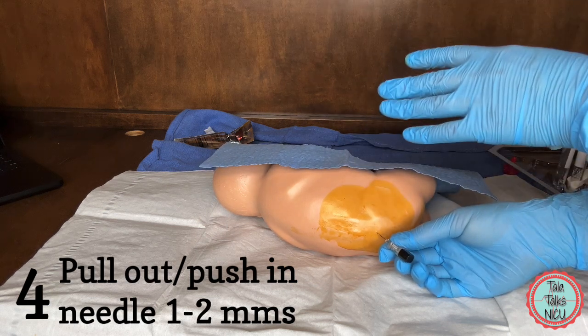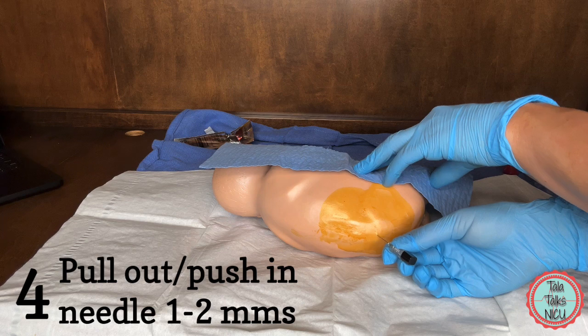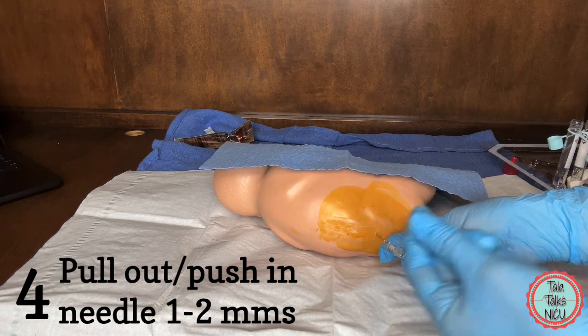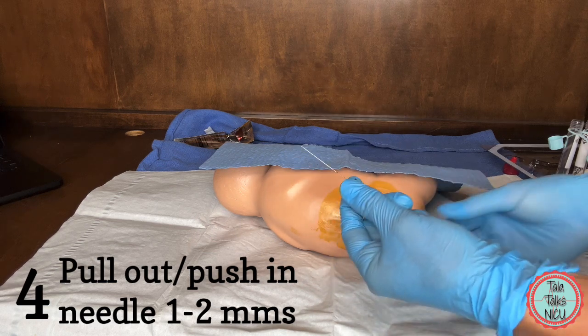There is an equation but it's kind of ridiculous. Pull out the needle or push it in slightly further. Remember, if you're moving it more than one to two millimeters, then always put the stylet back in.